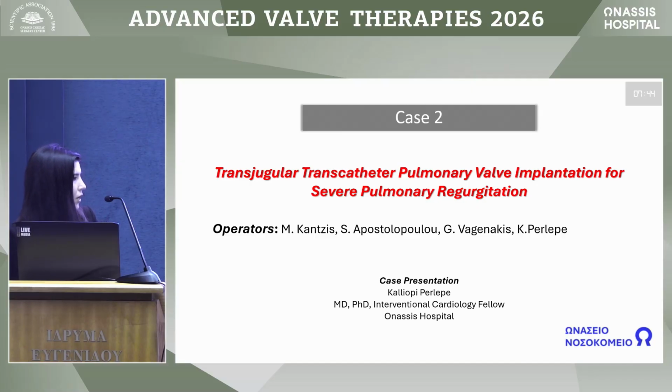27 Magna Ease. So the external ID of the valve was 27. The approach of using two balloons we don't use, for instance, in TAVI when we want to crack a valve. So why do you do that, or do you not? We do that because we know that the maximal high pressure balloon that we have is 26. We do not have more than that.